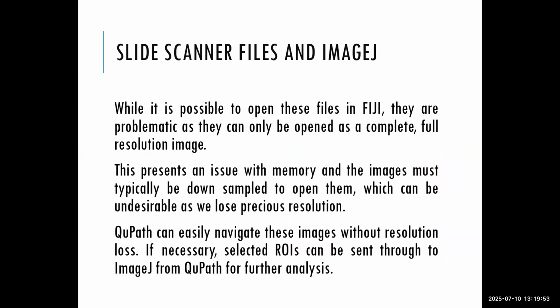That's essentially the same thing over again. It's usually a memory issue. Even if we have a computer with a lot of memory, ImageJ just can't really access it very well. So we have to downsample them in order to open them, which essentially leads to undesirable artifacts.